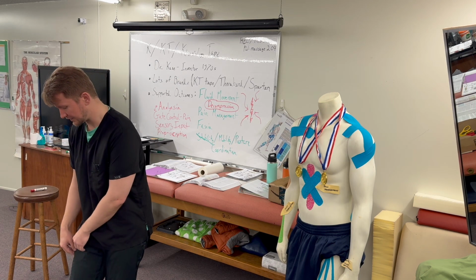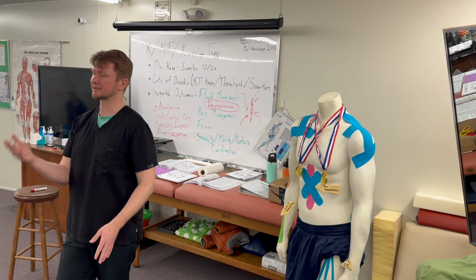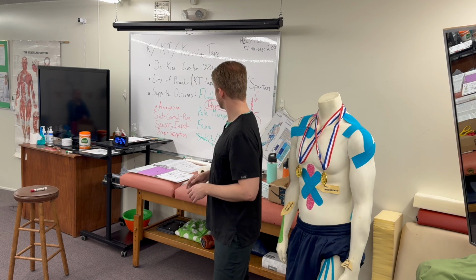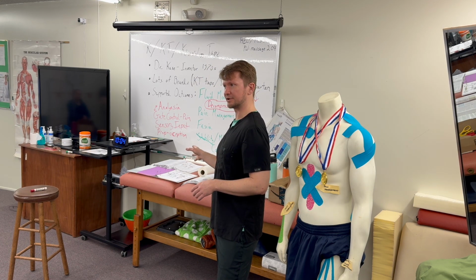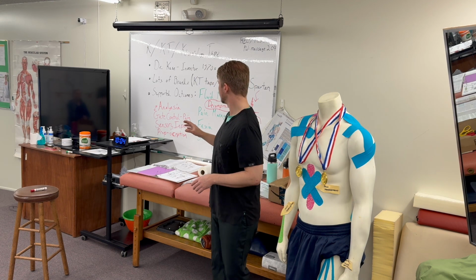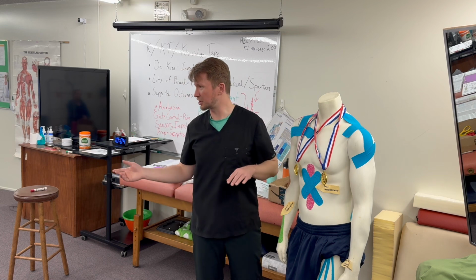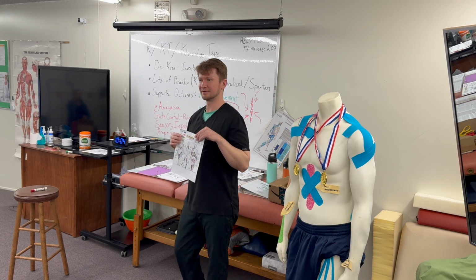Anytime they're making their skin move at all, plus that tape, we're encouraging that lymphatic fluid movement. So, that kind of gives the blueprint of how and why a lot of this works. If I want to say where I think it has the most value, it's related to pain management. Now that's why this one, on the chart, by the way, I just didn't have any more room on the body, okay?